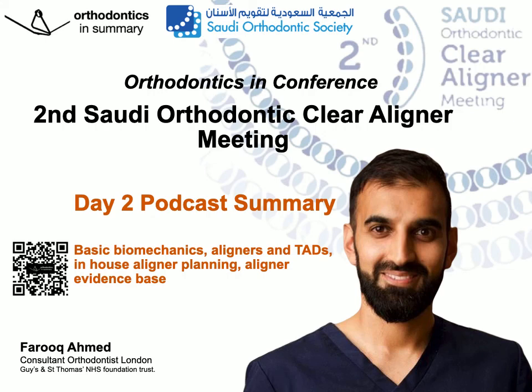Key spoke about developments in aligners, and it was really interesting. He's working in conjunction with a Southeast Asian company, and they're looking at printing directly to aligners, but also means he's customizing the design of the aligner, changing the thickness where required, and making things more efficient. And I look forward to seeing Key's research in that respect.